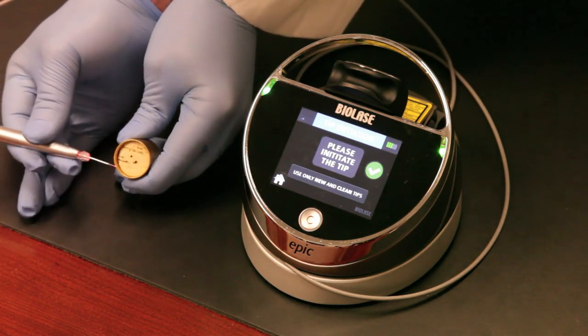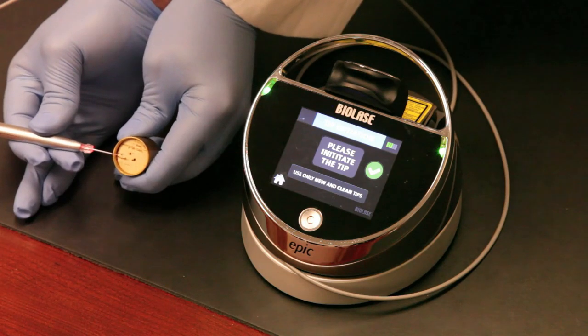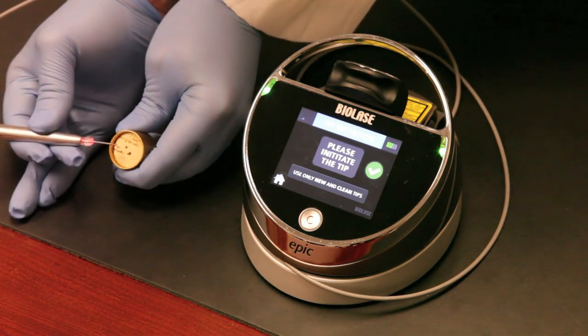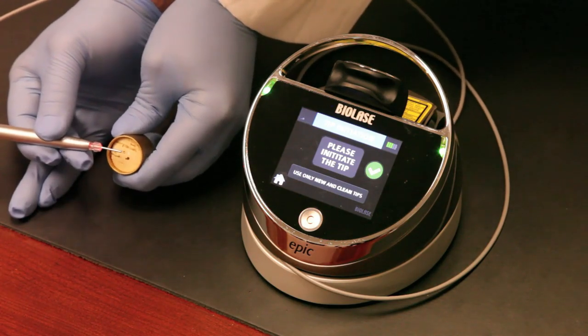You'll initiate the tip prior to any sort of soft tissue surgery. You will not initiate the tip if you're using the laser for things like canker sores, aphthous ulcers, or herpetic lesions — all those things require just blanching of the light.